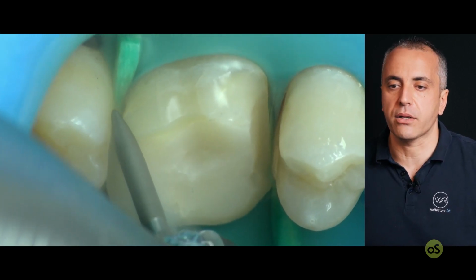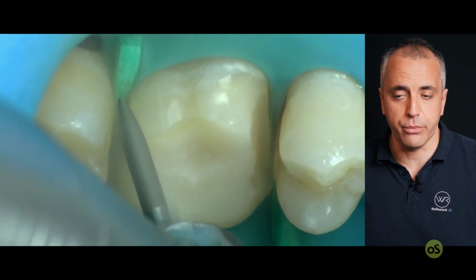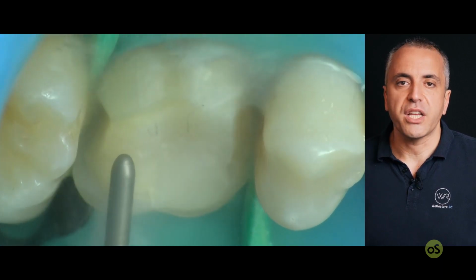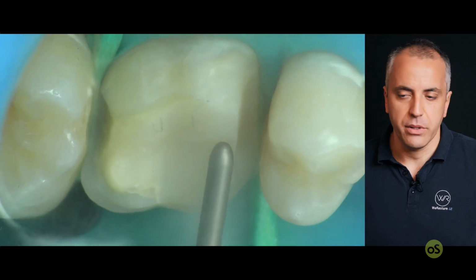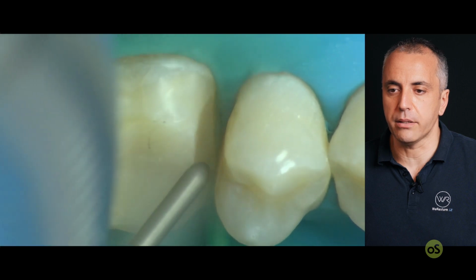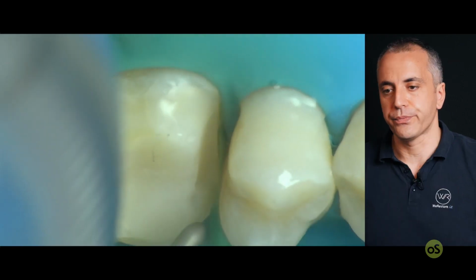This is the last connection between the distal box and the buccal portion. And once again, some finishing and smoothing on the occlusal part because it was prepared with the quite rough burr. And you see the angles are removed, are smoothed.